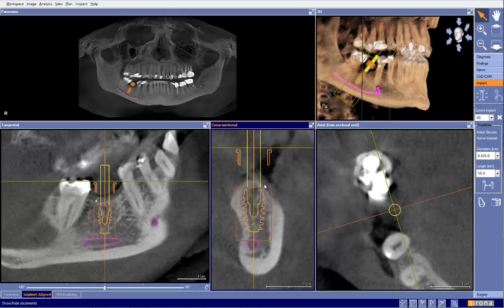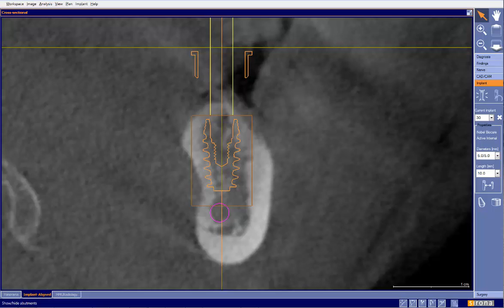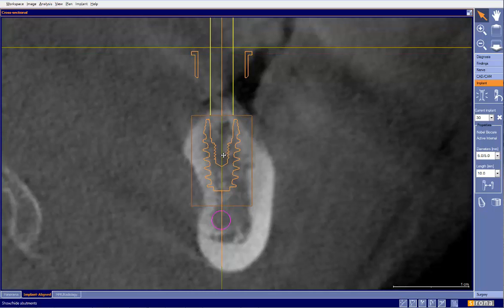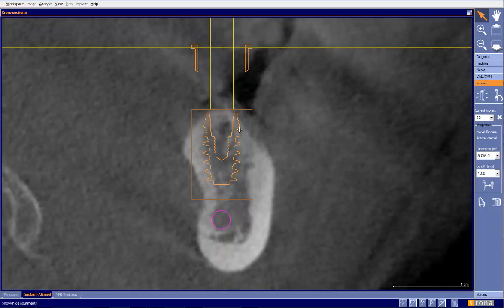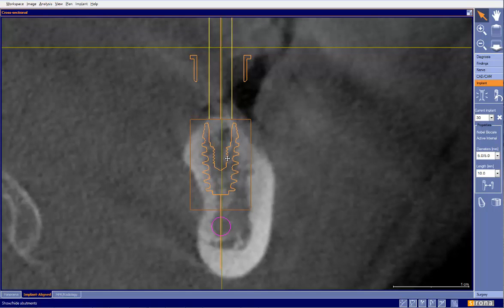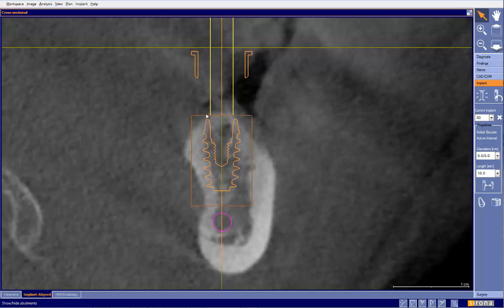Bone level: if we take a closer look at this — and here we go with the drawing — I see bone level to be about right there. Our implant is placed right here, so we have all of this space where we're below the bone level. Now I'm an advocate of slightly subcrestal placement, but this is probably a bit much in this particular case. So I would want to go ahead and move that up to at least right there, because if we move it up much more, we may have some of the implant showing.